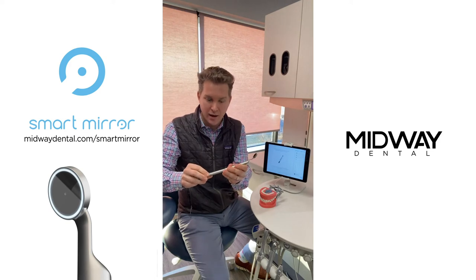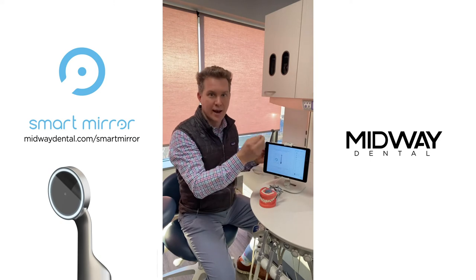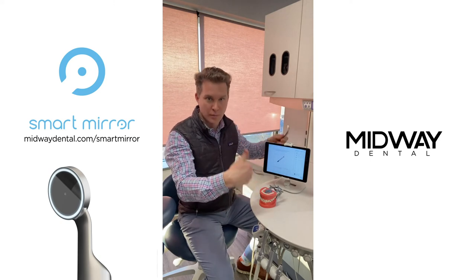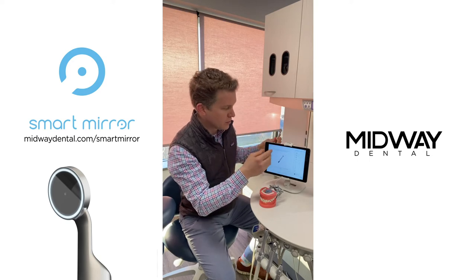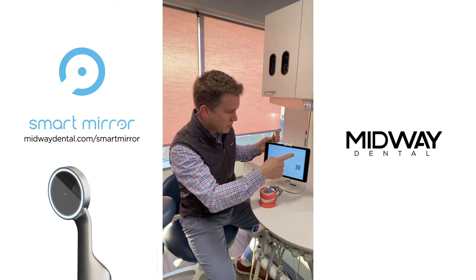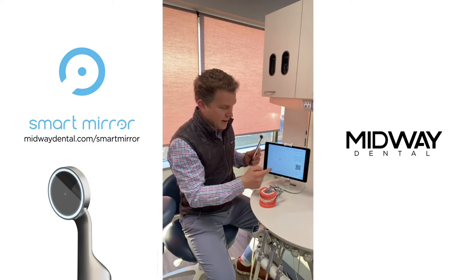To activate, I put the two pieces together and on a dedicated device — an iPad or iPhone, with Android devices coming soon — you will connect the mirror to the device via a QR code on the handle of the mirror. I'm going to use the camera on the iPad and now I'm connected.